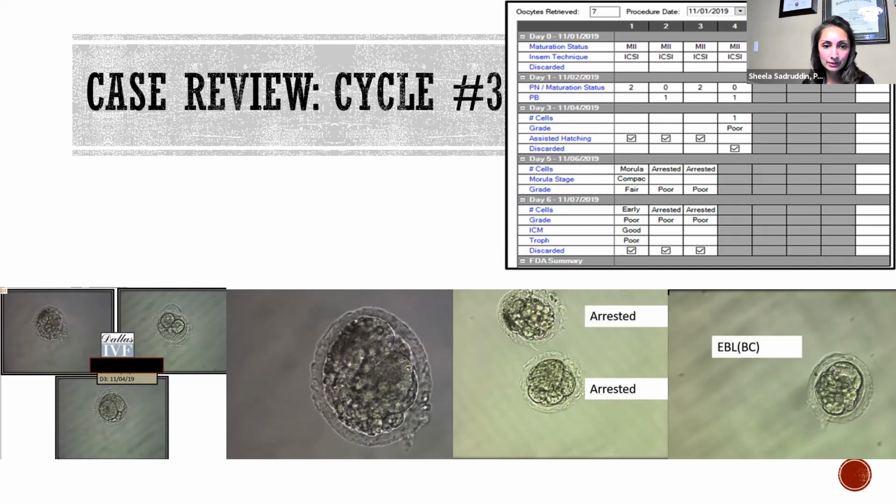And so we had 2 eggs that had fertilized normally. Of course, the patient was set up for embryo biopsies, which we all knew was very, very unlikely. And so on day 5, we noticed that there was a morula. I think we were extremely gracious in calling it that.